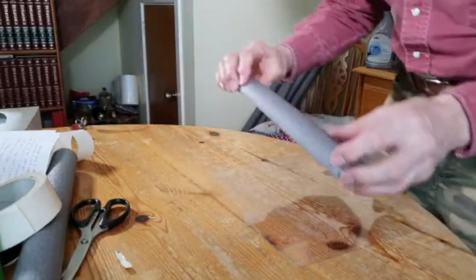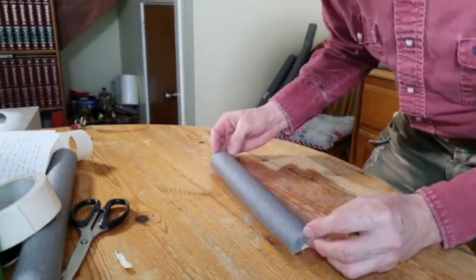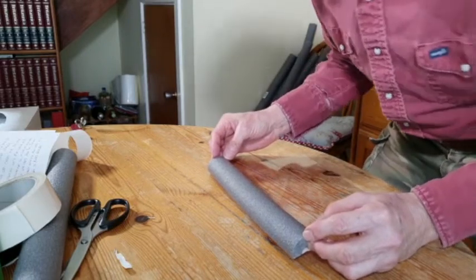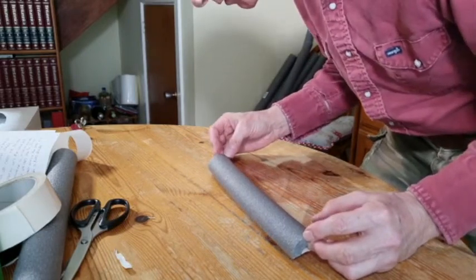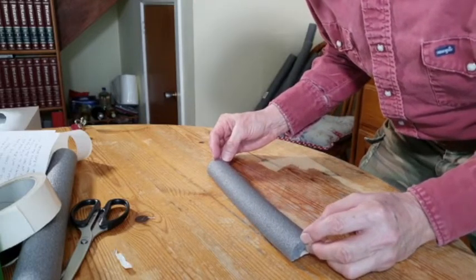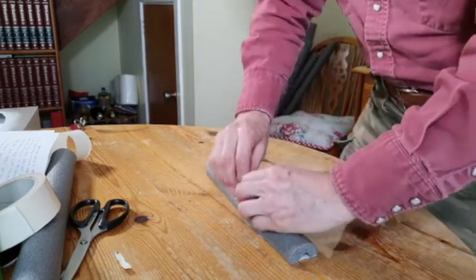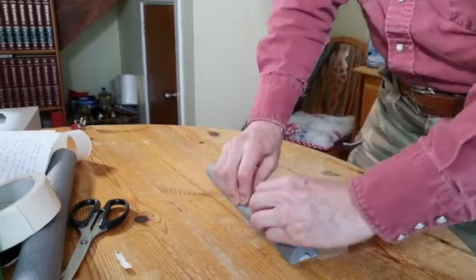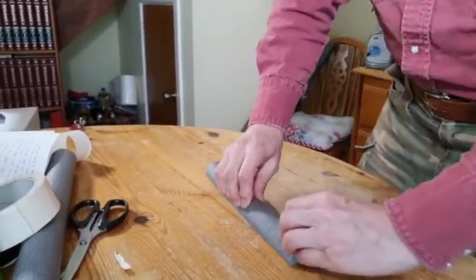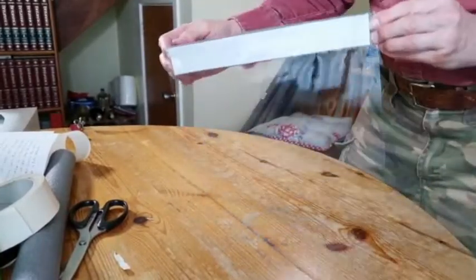Now, this is the bit where you've got to be careful. You've got to make sure that it's right on the edge, very, very close to the edge. Make sure there's a little bit of gap on each end, each side of the mask. Here we go. Now push it on firmly, all the way down, all the way along. It's now fixed to the mask.